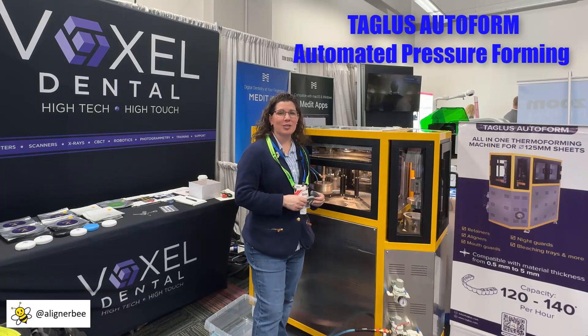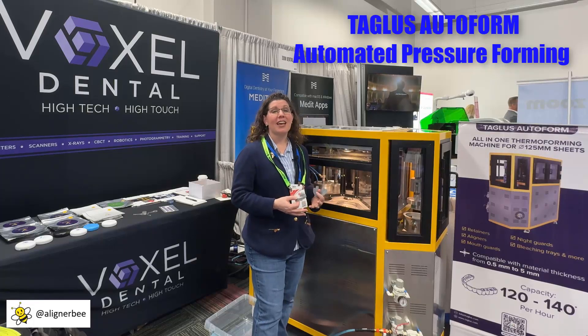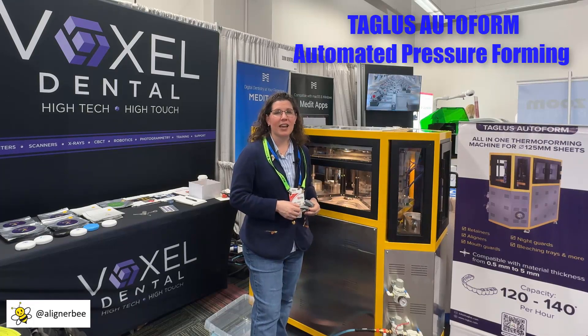Hi, this is Dr. Melissa Chotel, also known as the Aligner Bee, and I'm here in Chicago at Lab Day, checking out the new innovations in laboratory technology.